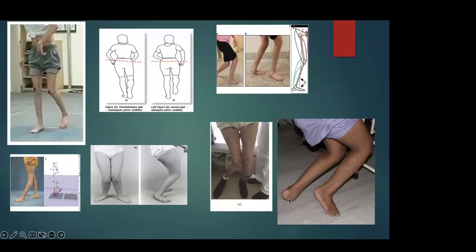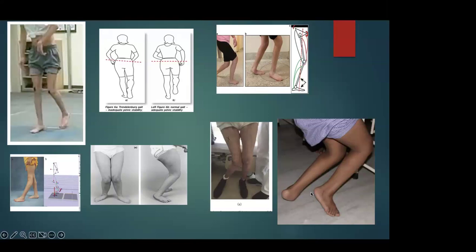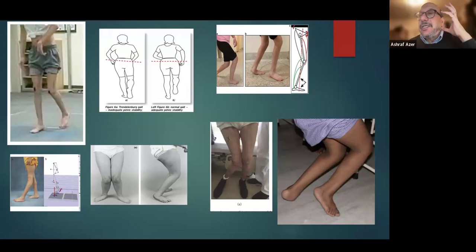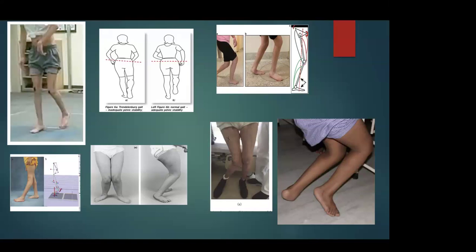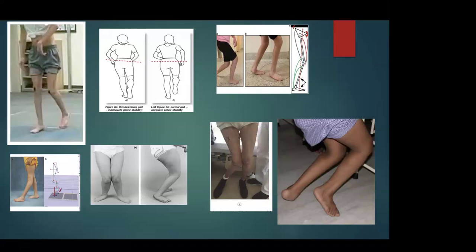What about this foot? So if I'm pulling your leg, So you are digging, you're putting yourself in deep trouble. Okay, go ahead. What is this foot? That's When you describe probably. it, think about the patient as a function, not as a foot. So, first of all, this foot is equinus. You want it to be plantigrade foot to be able to walk.